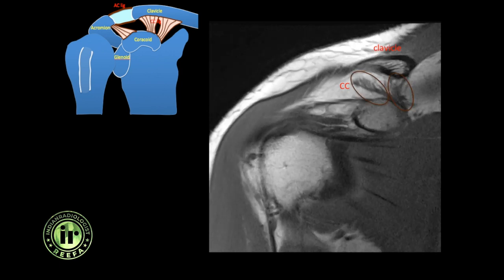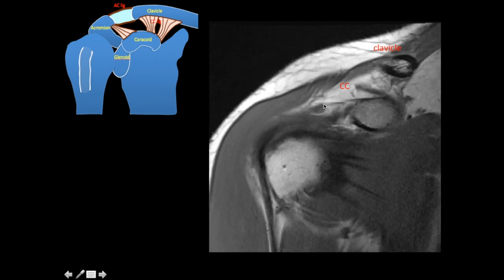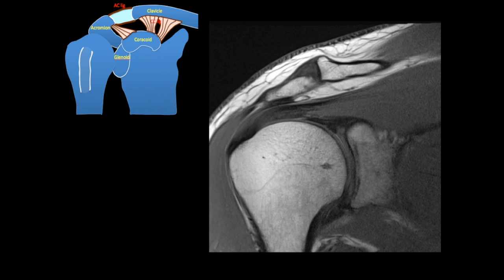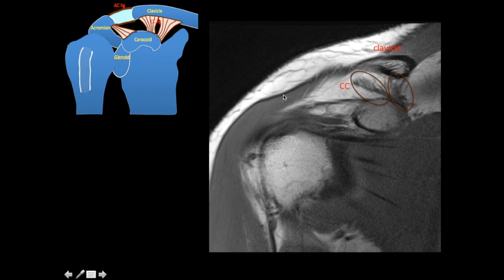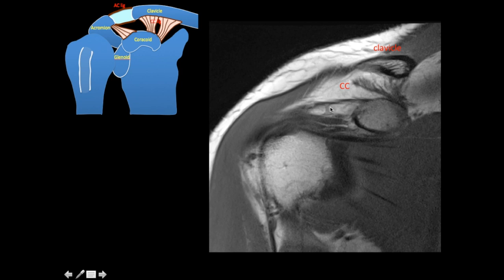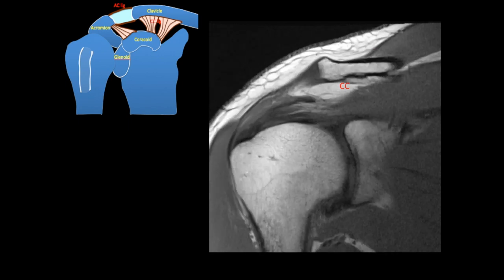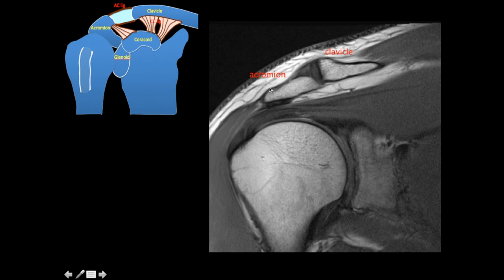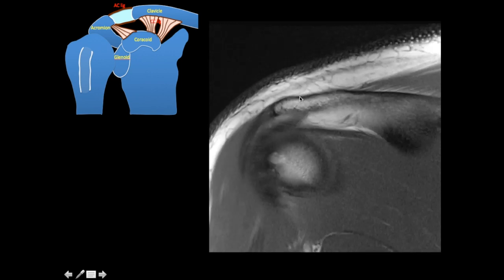Going back, you can also identify the coracoacromial ligament — tracing it shows it attaches to the undersurface of the acromion process. This ligament is not a stabilizer of the AC joint, but it is important because if the CC ligament is injured and not visible, you may mistake the coracoacromial ligament for an intact coracoclavicular ligament. Always trace both ends of a ligament before diagnosing whether an injury is present. More posteriorly you can see the superior and inferior acromioclavicular ligaments and the AC joint space.